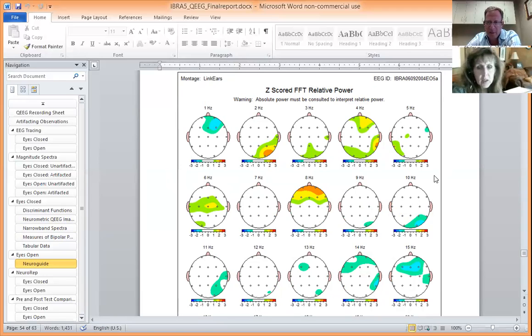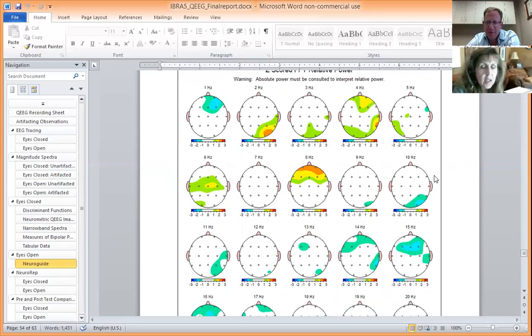As I looked at his performance on his last protocol, he really did not have much success in decreasing the amplitudes at the 2 to 7 hertz inhibit. So though he did well with coherence changes, he did not meet his inhibit goals mostly.